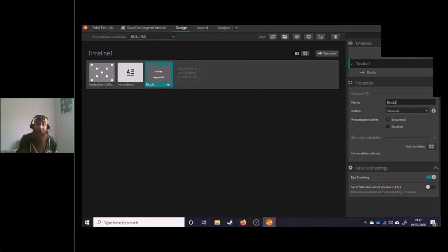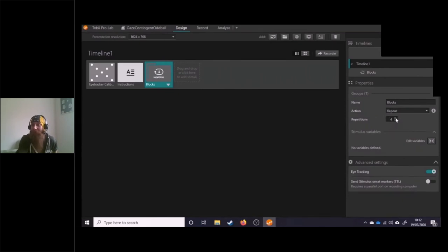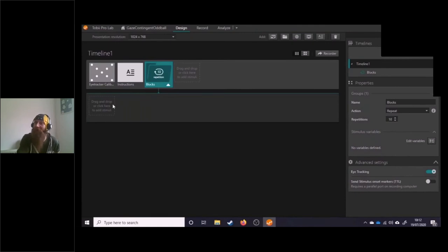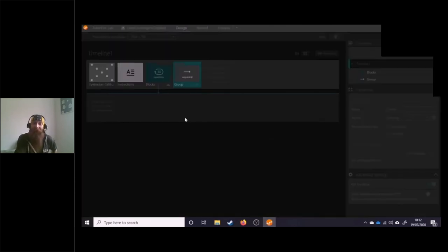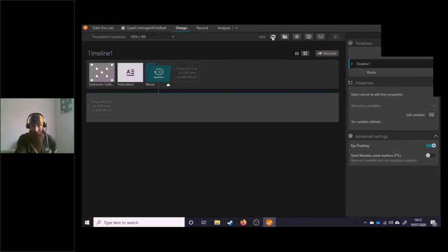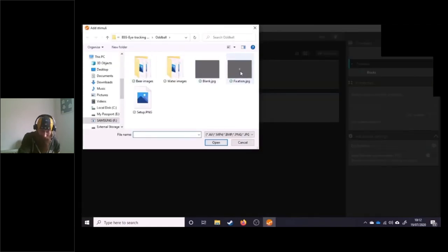A number of reasons for that include that actually this recording was taken on an old TV being used for a monitor. It has a resolution of 1360 by 768, which is odd even for an old device. So getting things to present at the native resolution is very difficult. These are things to be aware of.